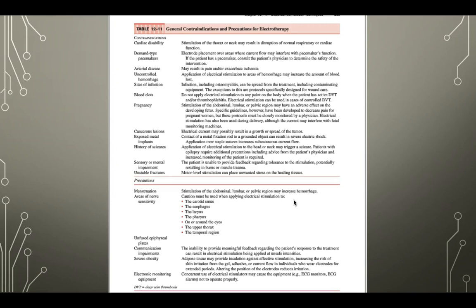Pregnancy. Pregnancy will end up being a contraindication for almost all of our modalities. And it's because we don't know what happens to the fetus when we apply these modalities to them. So if you're going to work with a pregnant woman, we almost never do the abdomen, the lumbar, or the pelvic region. And if you're going to do it in other areas, they should have a conversation with their physician about that and if it's needed. Any cancers. The current could possibly increase the growth or the spread of the cancer, so we don't want to do that.